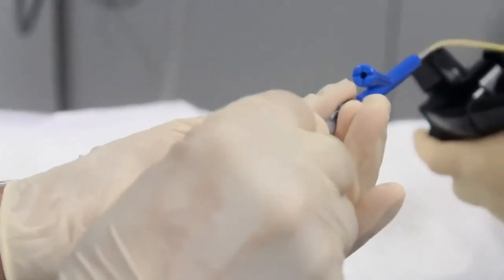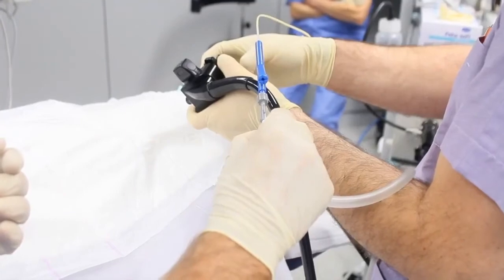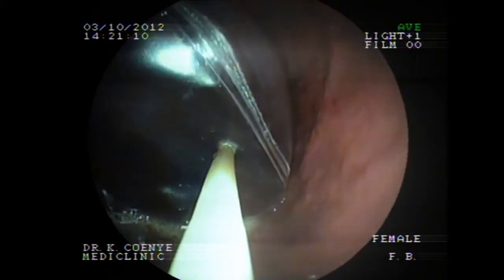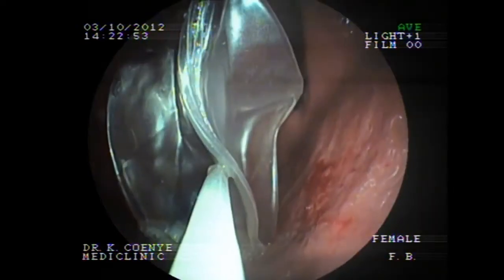Connect the catheter to an aspiration tube to completely deflate the balloon. A minimum of 5 minutes must be taken to deflate the balloon. This minimum time is essential for the successful completion of the procedure.